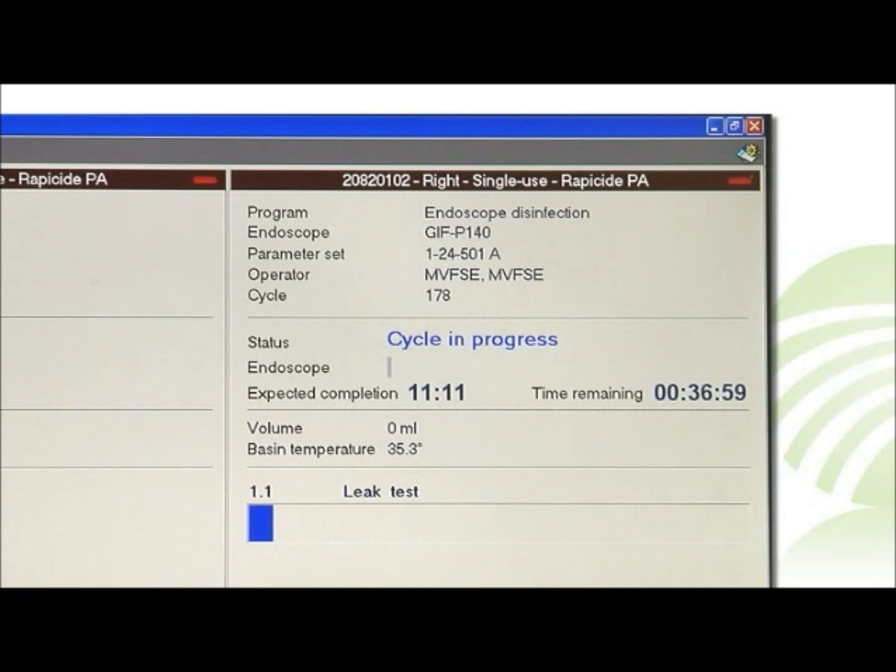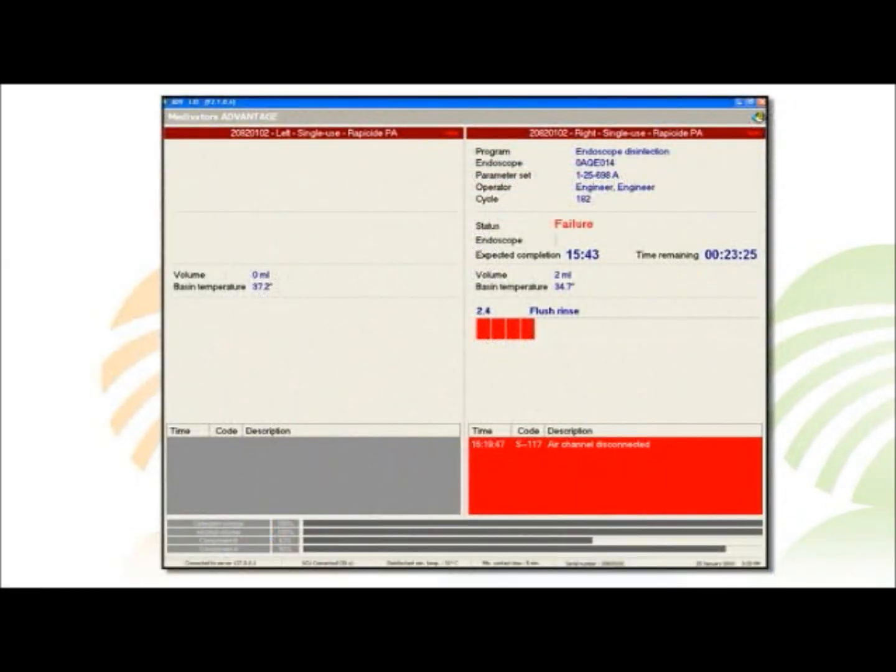The phase following the leak test monitors channel connectivity and blockages. If the system detects a channel disconnection or blockage, an error message will display on the program screen and the cycle is halted.